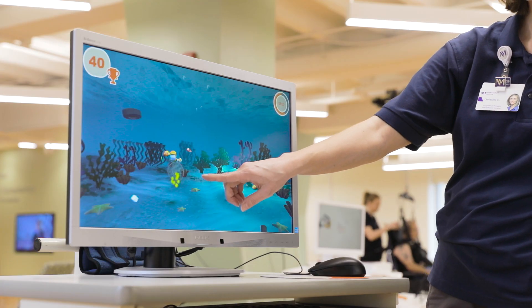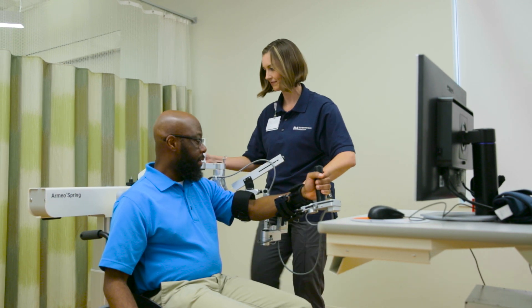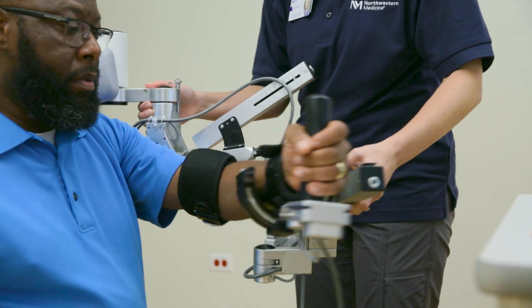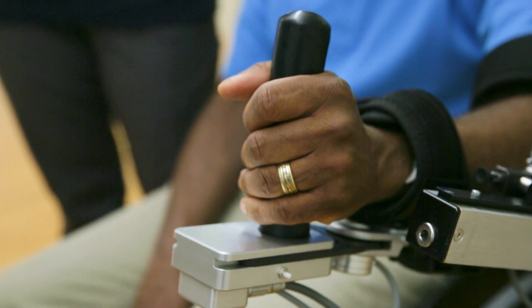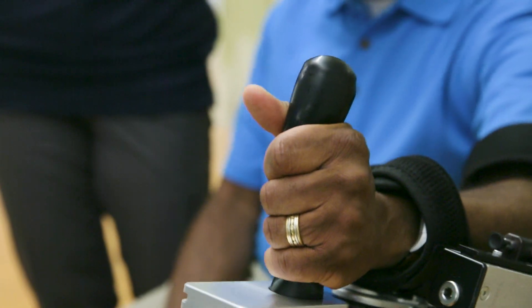Ergonomic and adjustable, the robotic exoskeleton embraces the whole arm, from shoulder to hand, counterbalancing the weight of your arm. A pressure-sensitive hand grip, which detects even small amounts of grip force, facilitates grasp and release exercises.